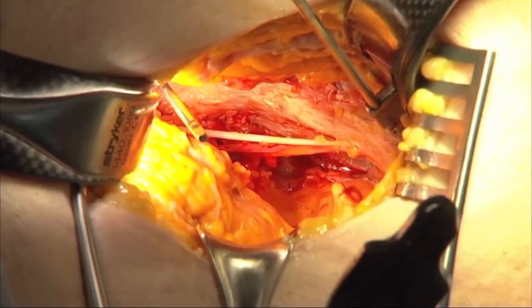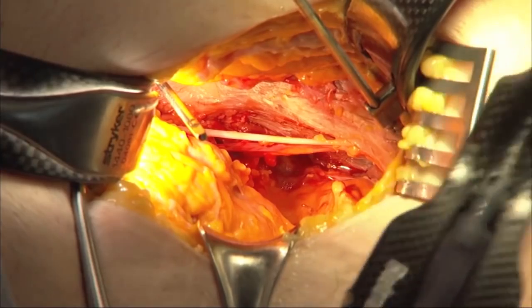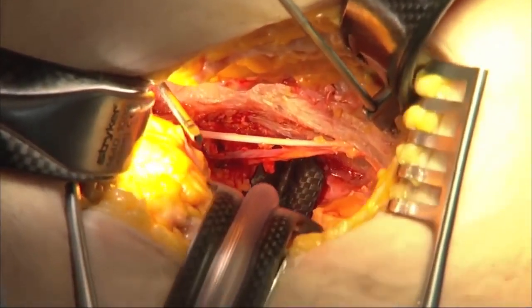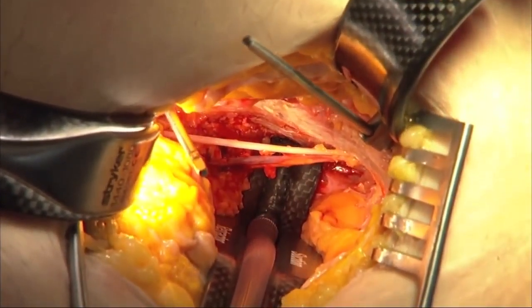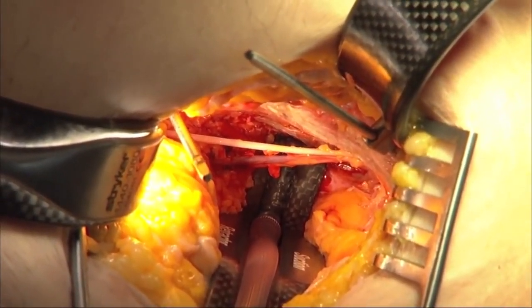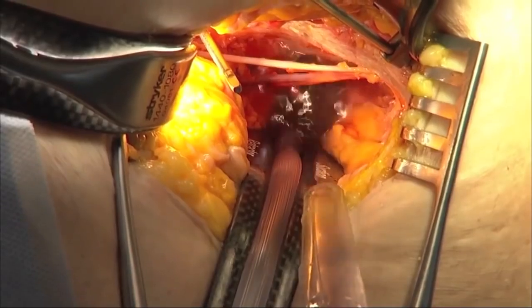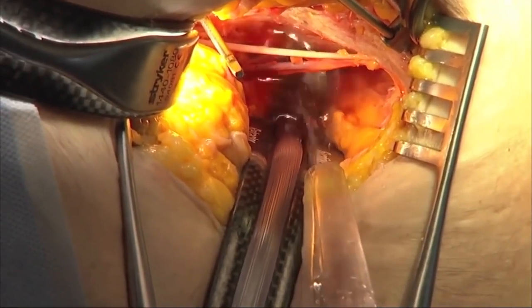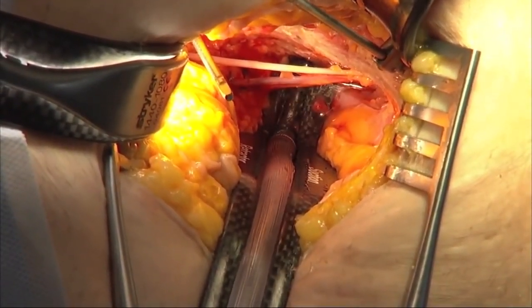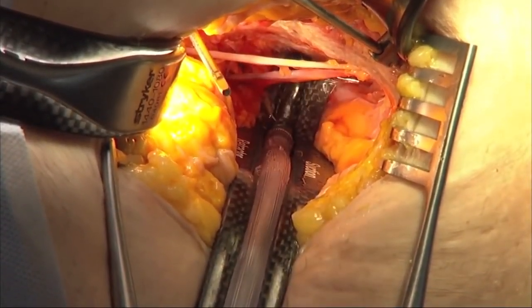The other thing that's really nice about this retractor is that we can hook suction up to it. If you take any suction tubing with a small plastic attachment, it fits right into the retractor. And then when you put the retractor back into the greater notch to push the pelvic viscera out of the way, the suction is at the base of the wound. This is advantageous for us because as blood fills the bottom of the wound and tends to pool by gravity, it limits your visualization. But if you have the suction tip attached to this, you can see how it nicely is going to continually remove all the fluids and the blood from the base of the wound, and that really helps to improve the visualization for us as well.